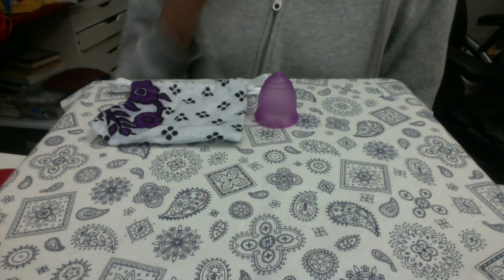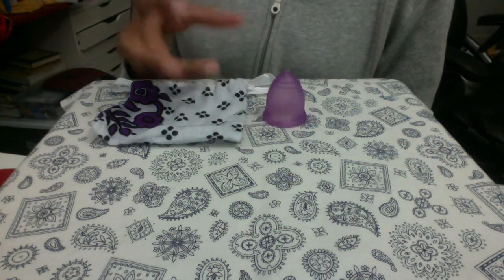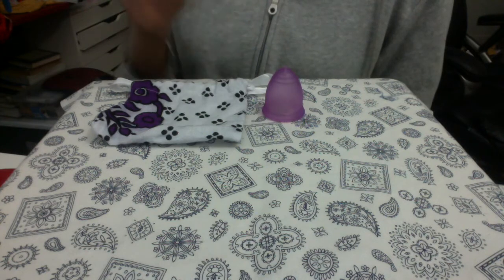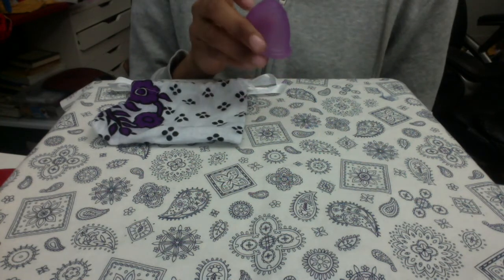So for me, I like when the grip rings are not too prominent because the cup is usually sitting so low in my vagina that the grip rings can be irritating because they're very close to the entrance. I find grip rings to be irritating sometimes, so I like that these are not very prominent.